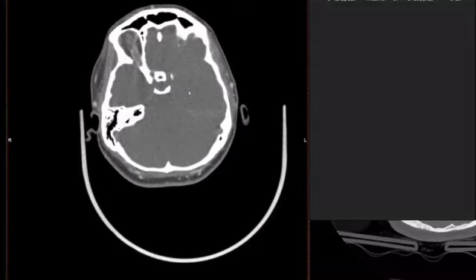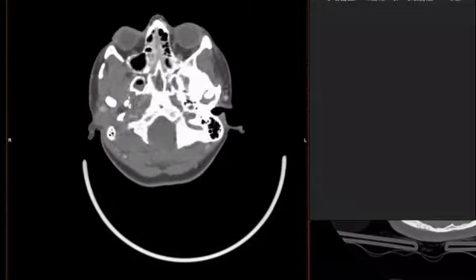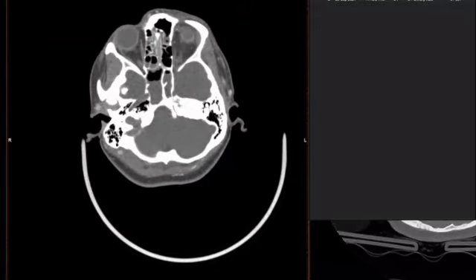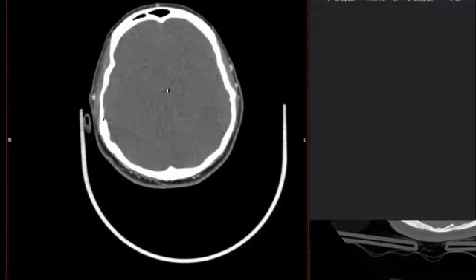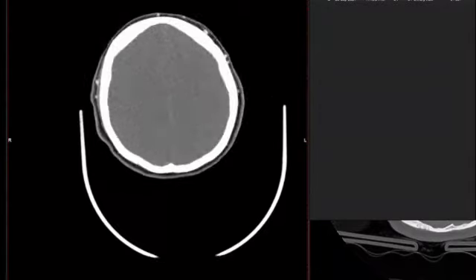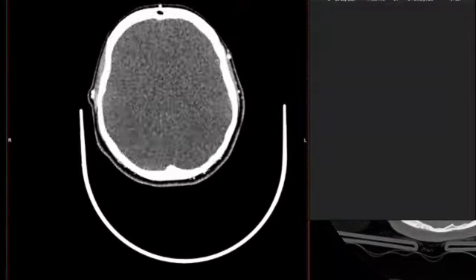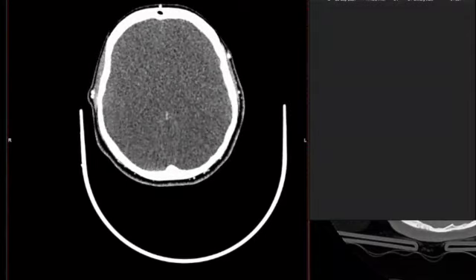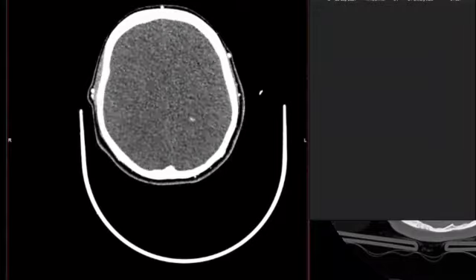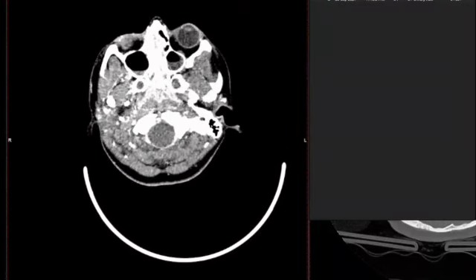We don't use the word perfusion. This is not a test for perfusion. This is simply a test to say whether blood with contrast in it has managed to flow into those vessels. So you're looking here for the cortical branches on the CT angiogram. There's absolutely nothing, and on the CTV, the internal cerebral veins, there's absolutely nothing there. So this is a positive scan. Left and right cortical branches, internal cerebral veins, absolutely nothing. So this would be a positive scan that would support the neurological diagnosis.